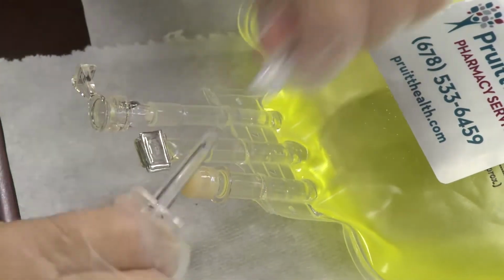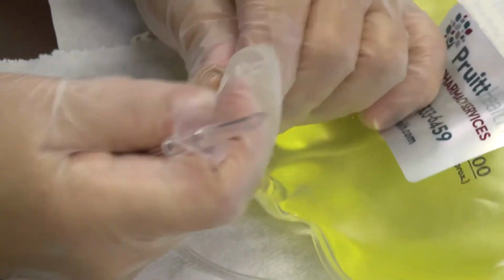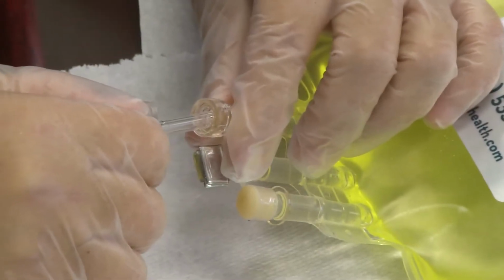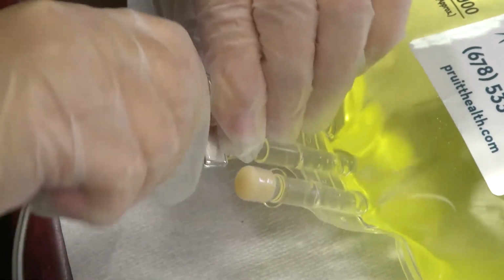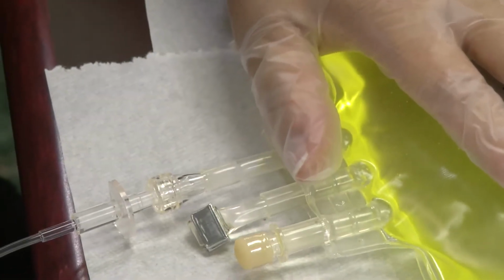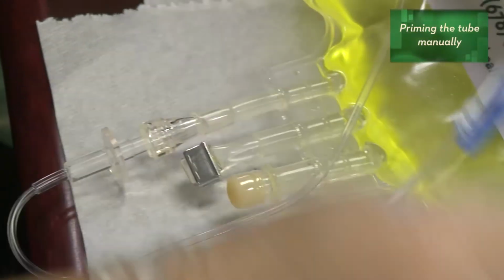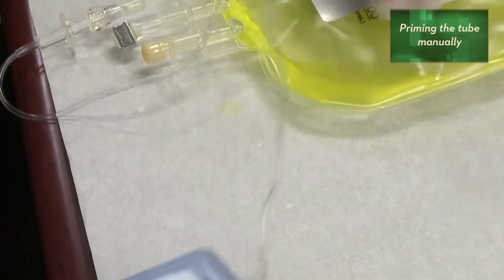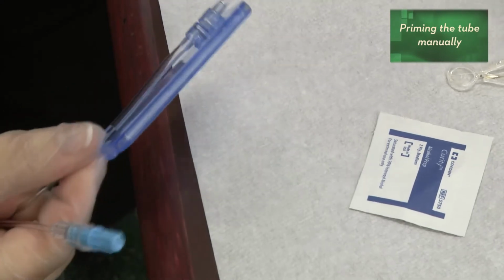So I'm going to take off the cap, throw it away, and I'm going to take off the end of this and throw it away. And you aim for this. You try not to touch anything that you take a cap off of, and you have to push and twist. And you know you've gotten it in far enough when you can see something start to move down. Once it starts to move down the tubing, you want to be ready to have it fill this filter, and you fill the filter in the direction that the tubing goes in.